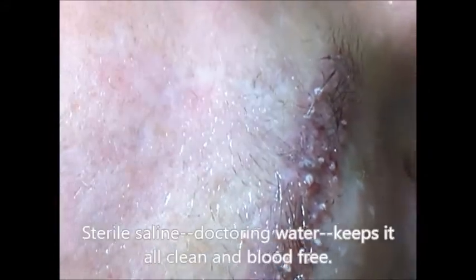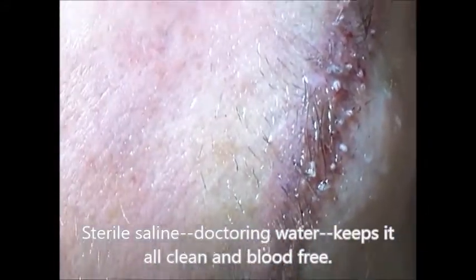Is that good? They're going in good? Yes. I think Christian might be a little better, but there are two here that are not deep enough, but I'll do it at the end. Okay. Does this hurt at all? I feel a little bit of fluid in my eye. I don't know what it is, but no, the procedure didn't hurt. Yeah, we just washed off some water. No, I didn't feel it at all. Great. Any pain so far? No, not at all. Pretty straightforward? Yeah. Super easy. You get them down in there good.